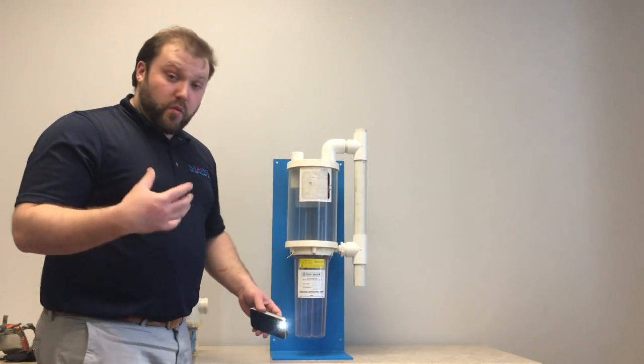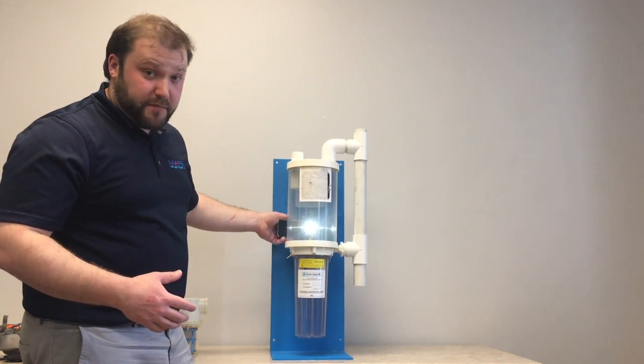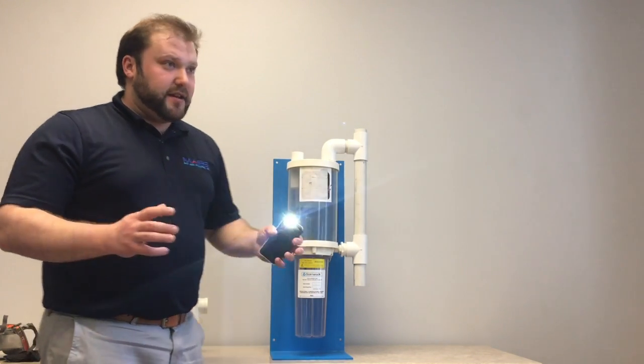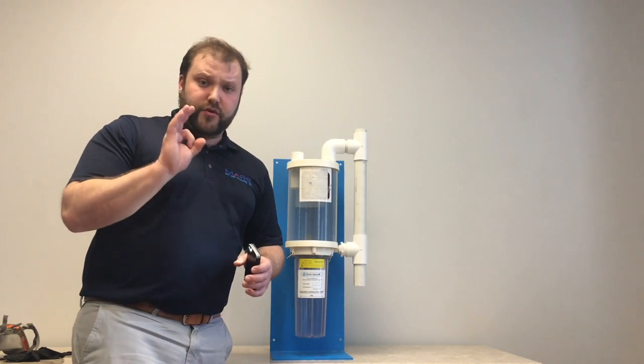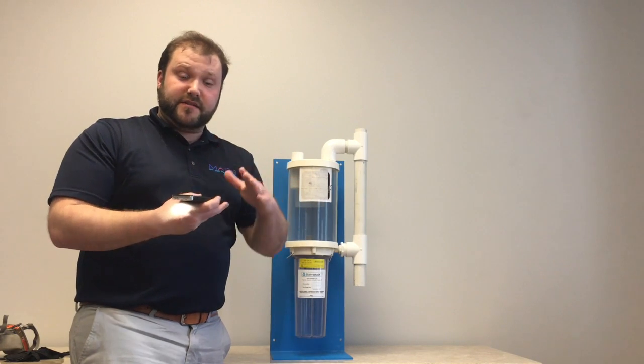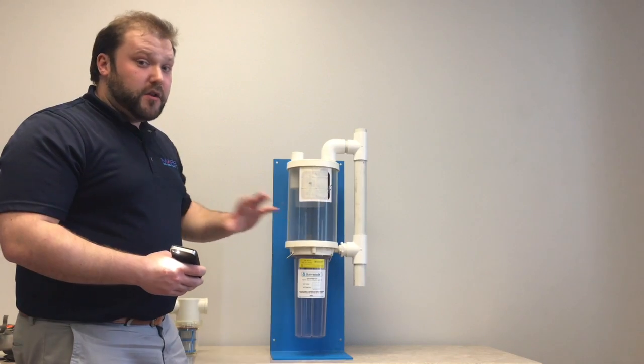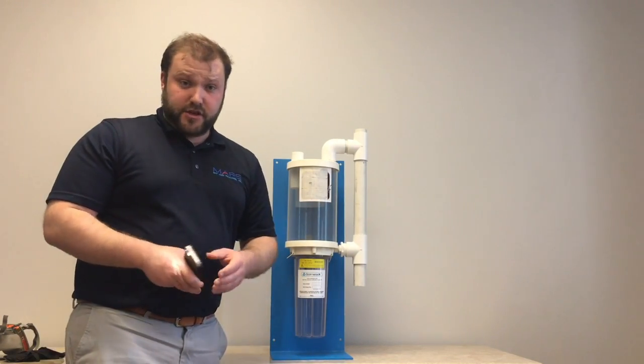While you're down there once a week doing this maintenance, I would also suggest shining in the upper chamber. The SolmeteX inlet is about a 3/4 inch inlet. And if a piece of biofilm sits on top of this, you may have something where your filter looks empty, but your upper chamber is building. Do not fret, there's a way of solving this issue.